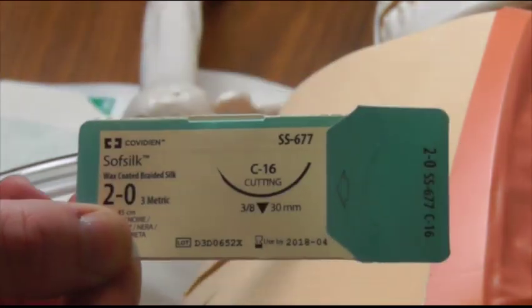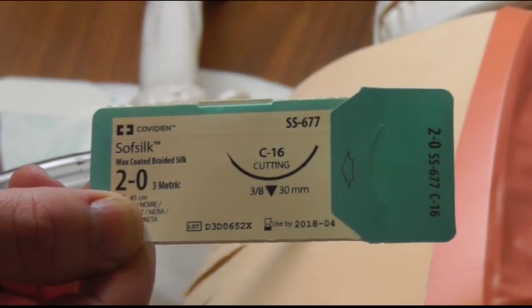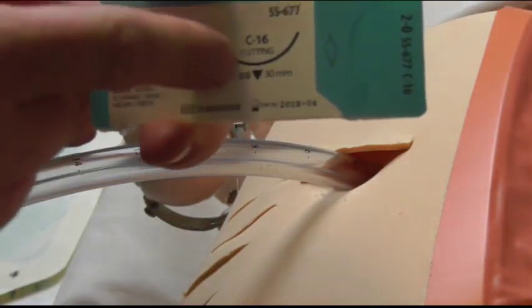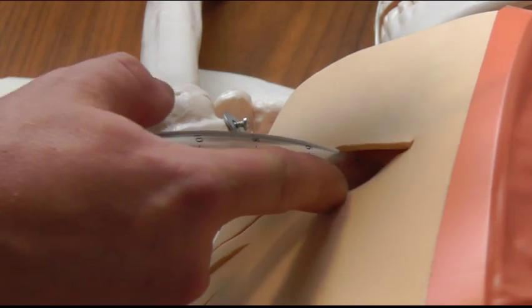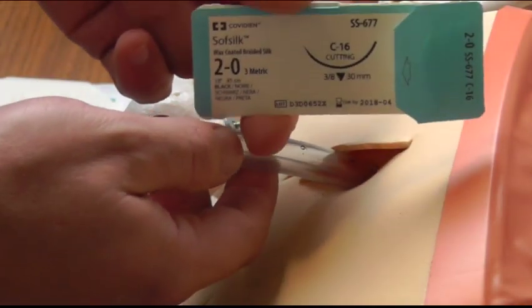There's this argument about silk versus nylon sutures. Silk grips the tube better and is much easier to tie, especially when your hands are all slippery and bloody in a trauma, but the braid in silk theoretically makes it more likely for bacteria to crawl into the wound. Nylon sutures are slippery around the tube, they're harder to tie but have a lower infection rate.